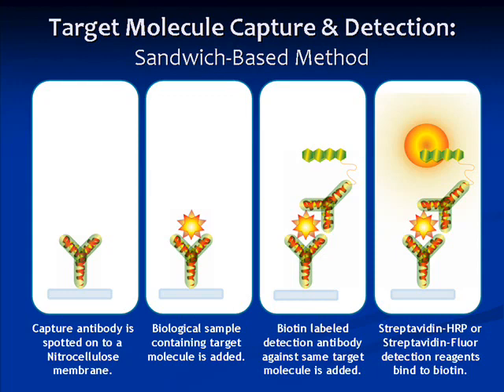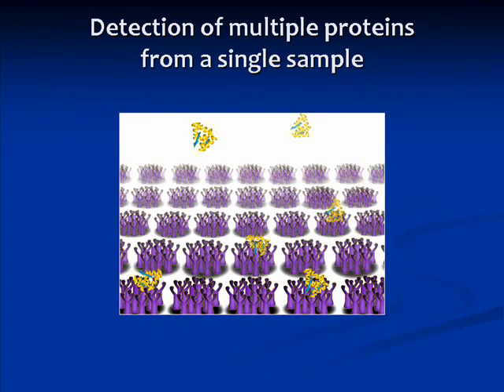This procedure requires minimal hands-on time, and results are obtainable usually within one day. Each array contains scores of antibody spots, each of which is specific to a different protein, thus allowing the simultaneous capture of many target proteins.